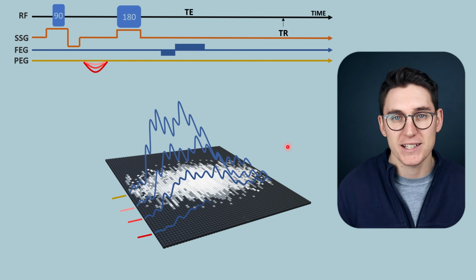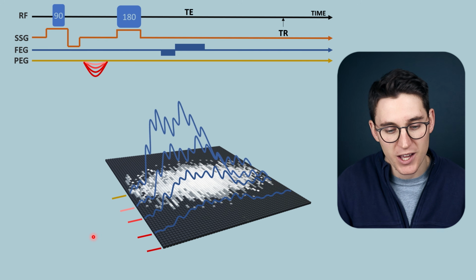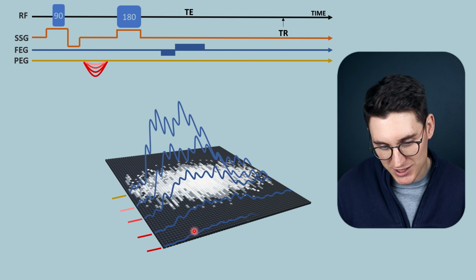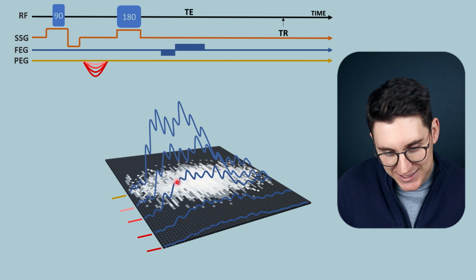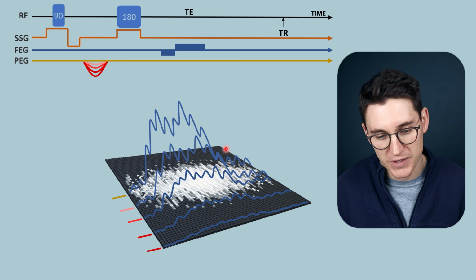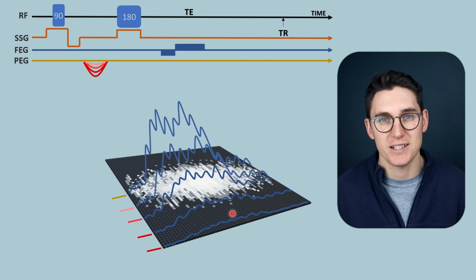And the stronger that phase encoding, the less the actual signal that we are going to get out. Eventually, we will use our strongest phase encoding step along the y-axis direction and measure some form of data acquisition. Now you can see the strongest signal we get is at the center of K-space, when everything is most in phase with one another. The more we head out to the peripheries, the more we lose that signal.